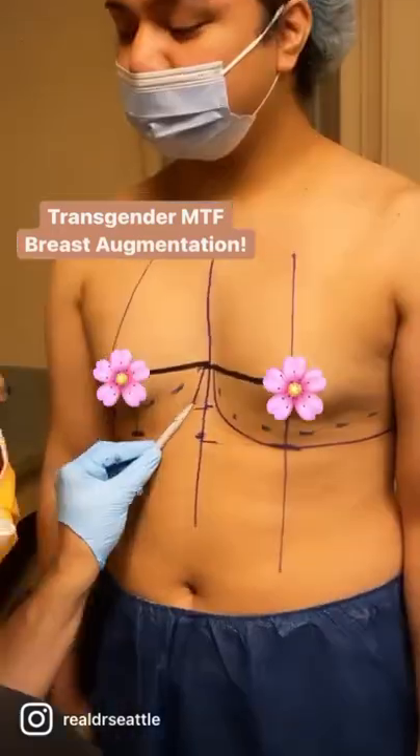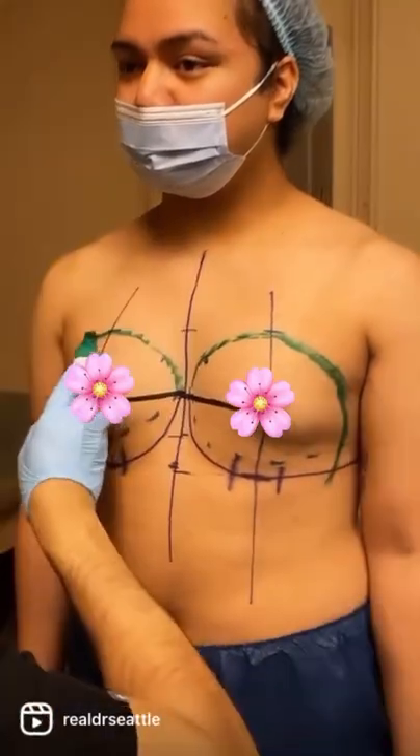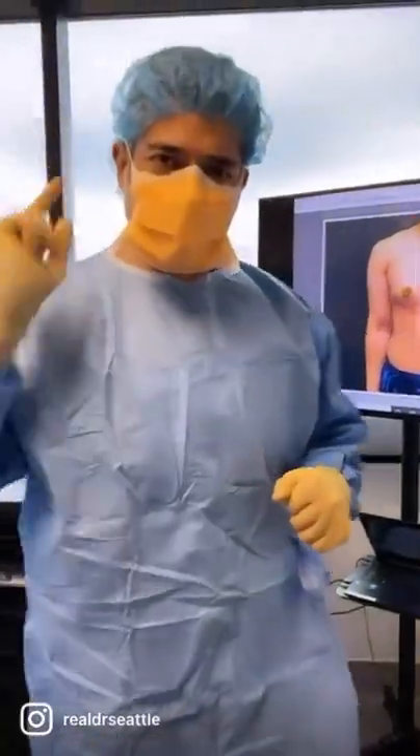We're going to be starting with our gender-affirming breast augmentation. Welcome to the operating room, guys. It's time for breast augmentation. This is going to look amazing. Let's do it.